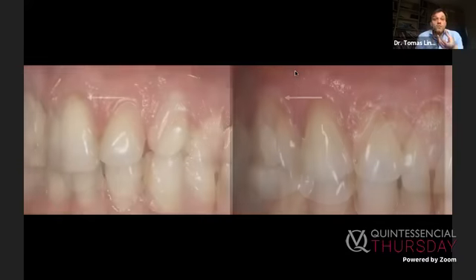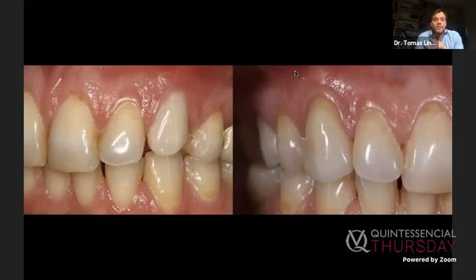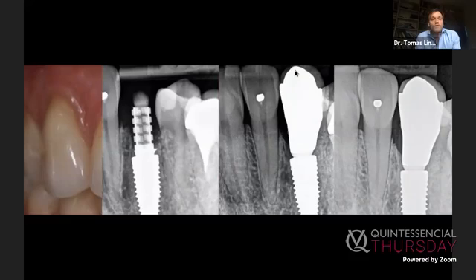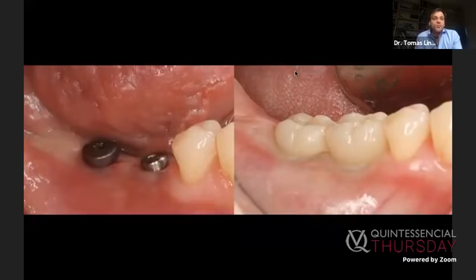Now, of course, when I prepared this lecture, I started to think maybe it's not a good thing for anterior tissues. I mean, to have this kind of thing in an anterior tooth, maybe it's not that good. So again, we maybe can have a different discussion here. However, it's evident that with super polished zirconia the bone is stable here, and we can have growing of the tissues.